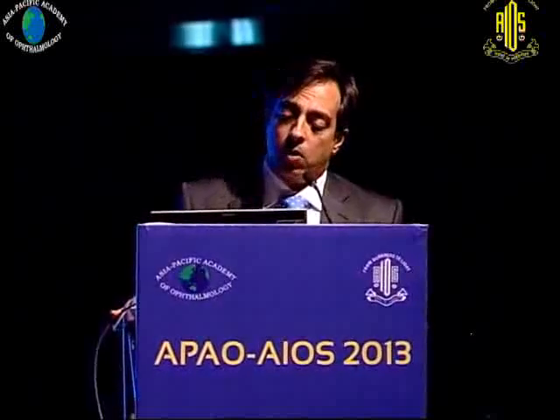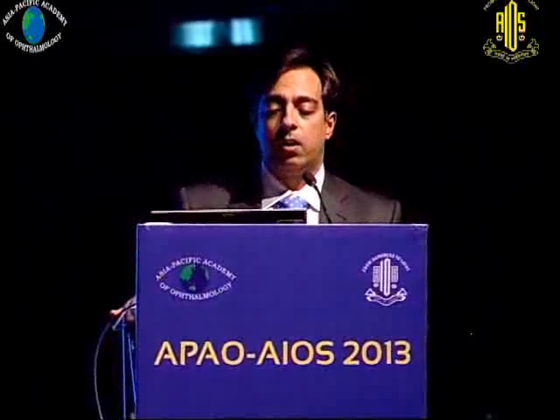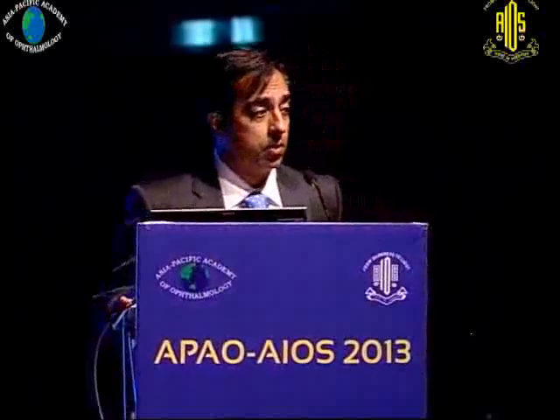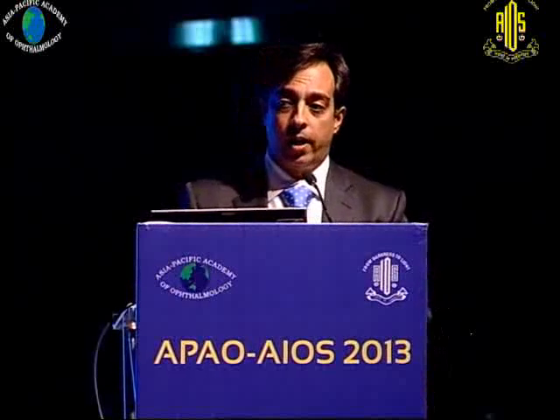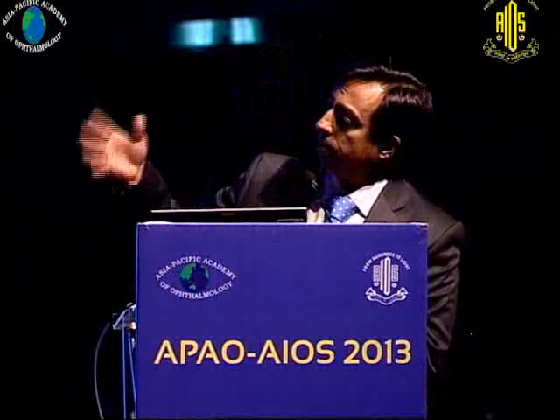So now we go on to a high mag lens and try and see and segment this whole connection from the rest of the vitreous, so that all you have is a small skirt of attached vitreous left on the foveal area.